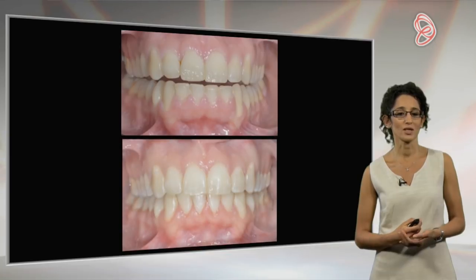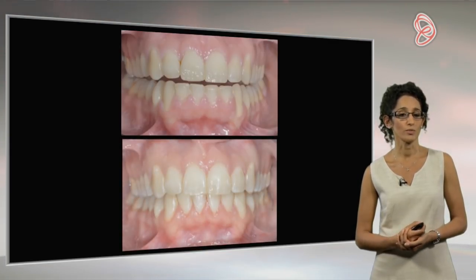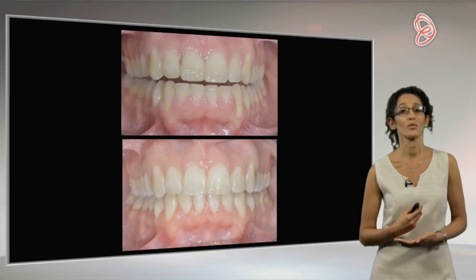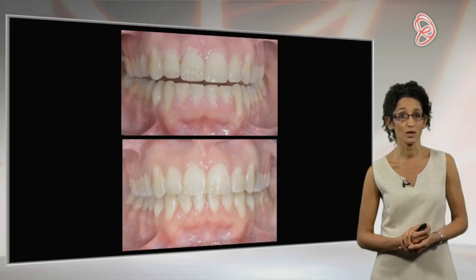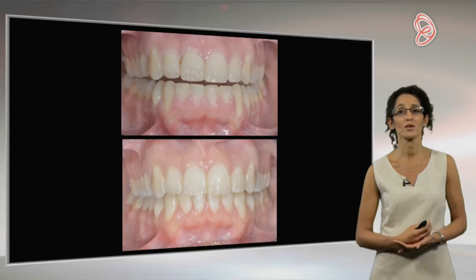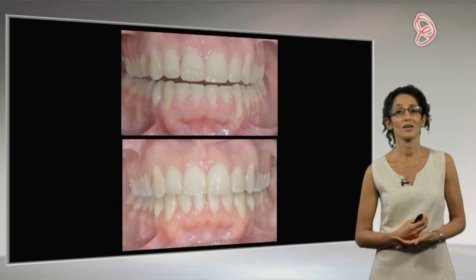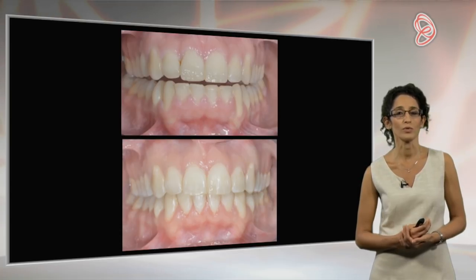But of course, you saw what his smile was like. That would have shown a lot. So this is the post-op. Other than the fact that we've removed the gum and we've removed the bone, because again, we've re-established biological width, he isn't having any restorations placed. But if I don't preserve that biological width, then ultimately the tissues will regrow. So we want that to stay stable.